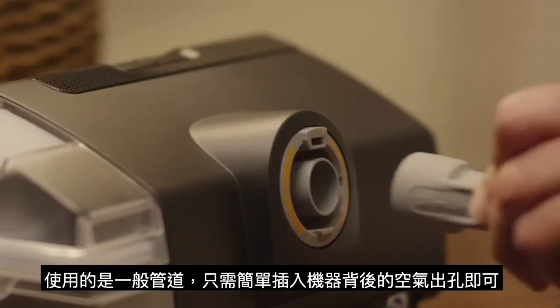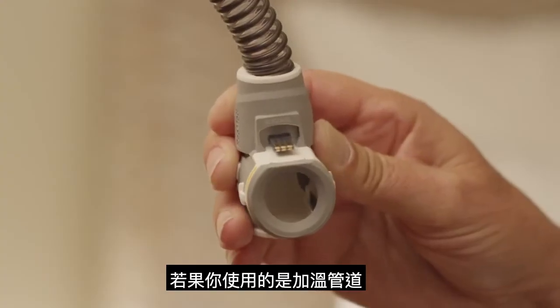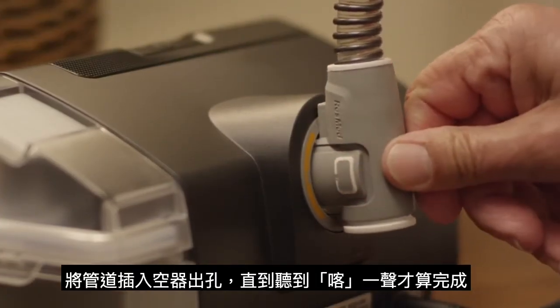If your machine came with a Slimline tube, simply connect it to the back of the device. If it came with a ClimateLine Air Heated tube, hold it by the orange cuff, line it up with the connector port, and push it until it clicks into place.